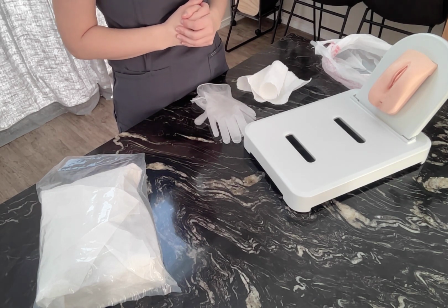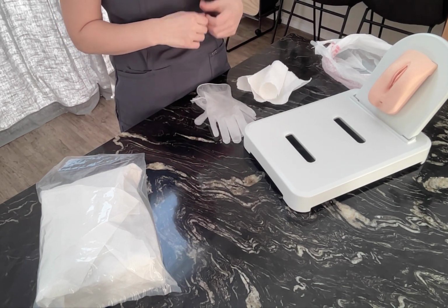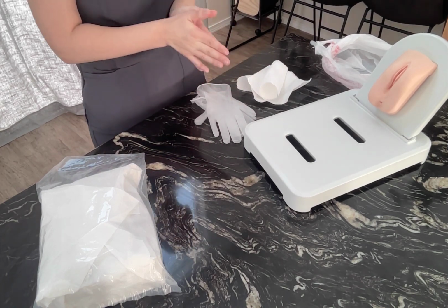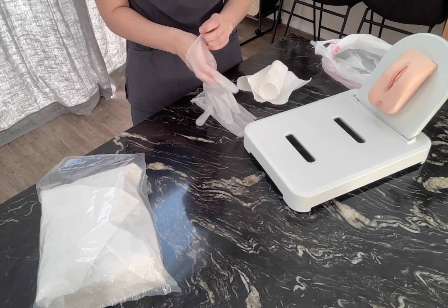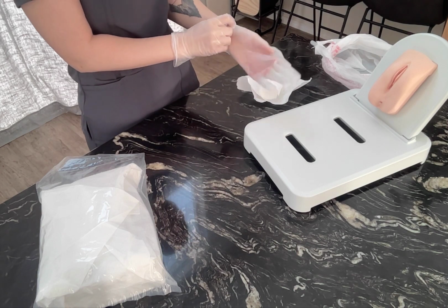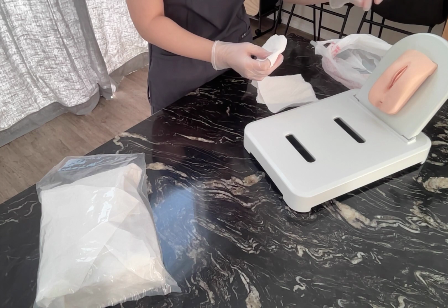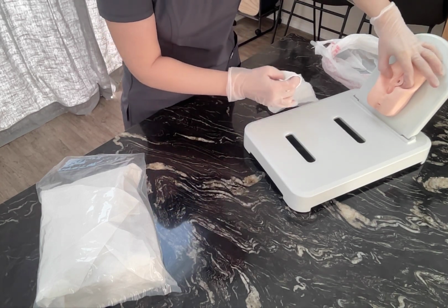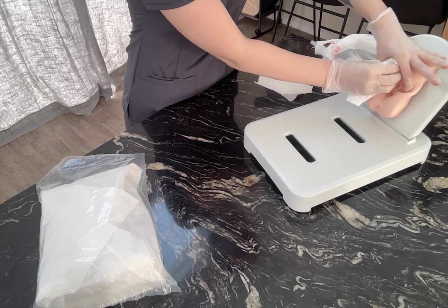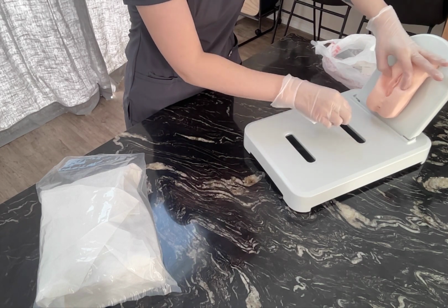All right, well, to begin, I'm going to go ahead and clean the perineum, and then I'll step out, get my supplies, and then I'll come back in and we will do the insertion. All right, Mrs. Smith consented, so I would go ahead and perform hand hygiene. I would put on non-sterile gloves. I would take three different cloths, and I would spread the labia, and I would clean furthest away from me, then closest to me, and then straight down the center.